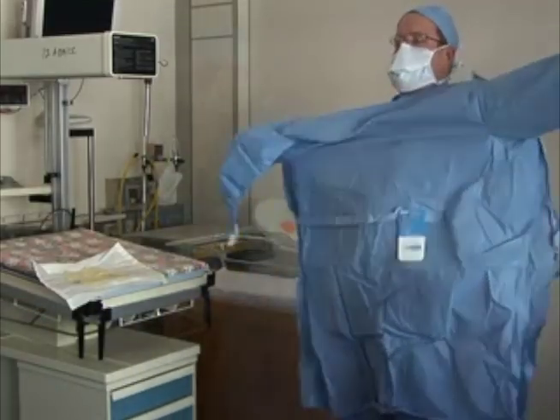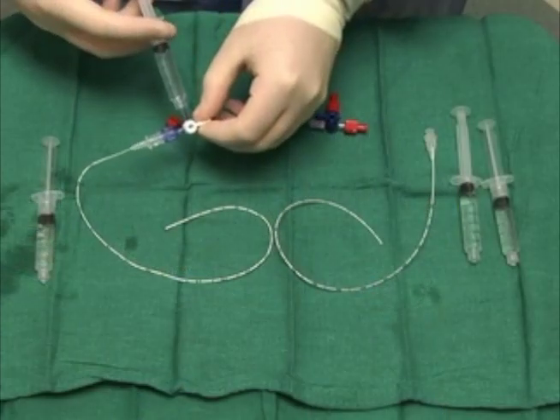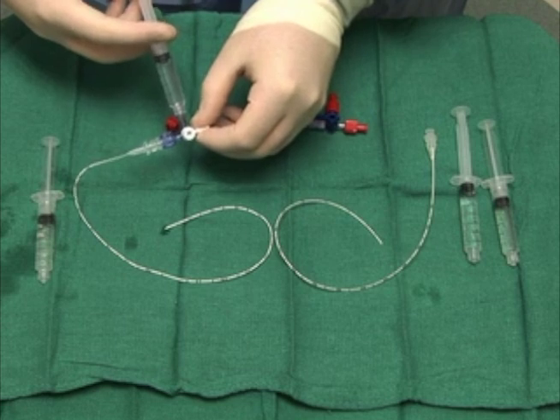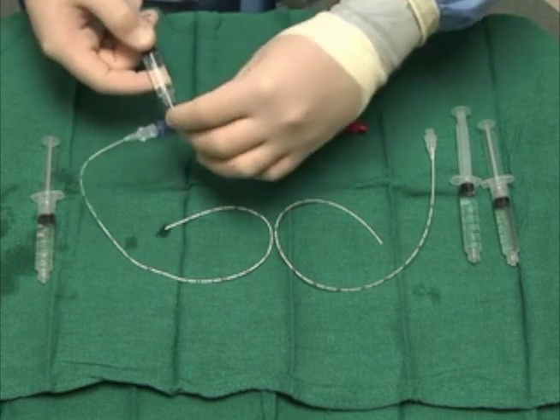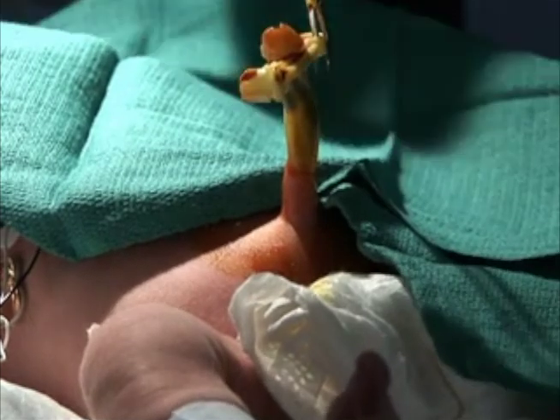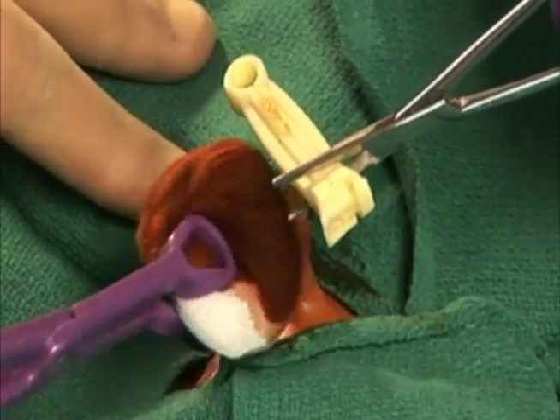After you are fully scrubbed and garbed to perform the procedure, attach a stopcock to the hub of each catheter and fill the system with flushing solution. Be sure each stopcock is in the off position. Ask an assistant, who need not be wearing a sterile gown, to grasp the cord by the cord clamp and apply traction vertically. Apply antiseptic solution to the cord and surrounding skin.